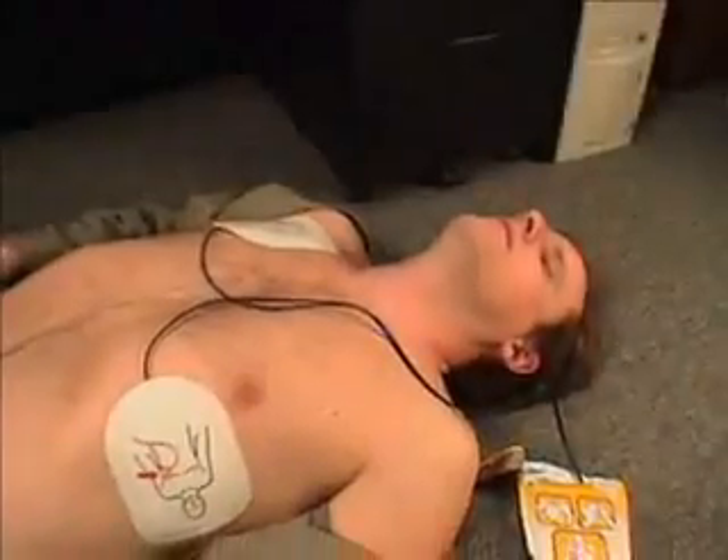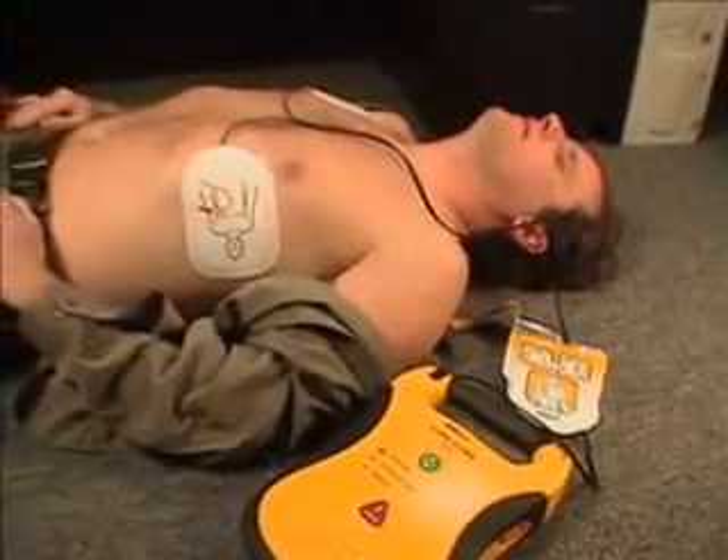No shock advised. The Lifeline AED will not shock a victim that does not require a shock.